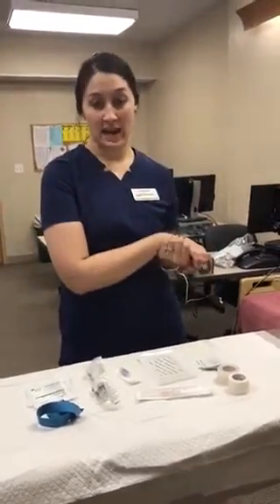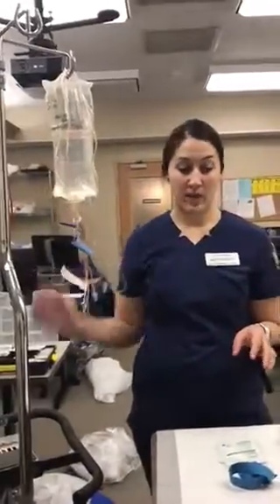I'm going to wash my hands, and then we are going to take all the supplies and the IV bag with us on this IV pole into the patient's room.